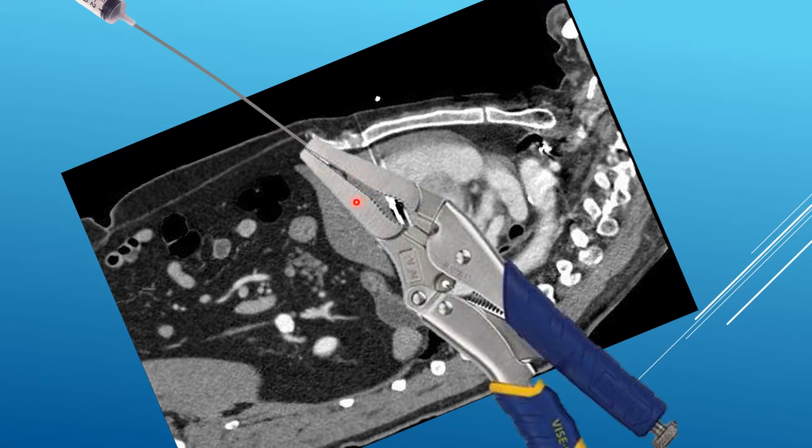So imagine the needle tip being in a kind of vice grip, and if you then try to make the angle shallower simply by lowering the syringe, you get a nice 30-degree angle on the surface and pat yourself on the back, but actually the bit you can't see that's inside isn't any shallower, and if you advance that needle, it will actually potentially go at an even steeper angle than before.